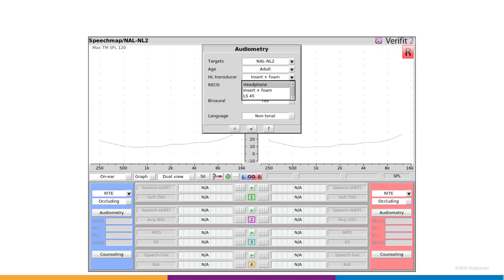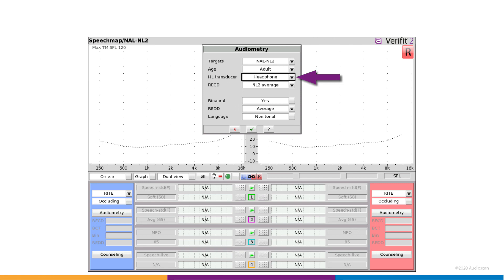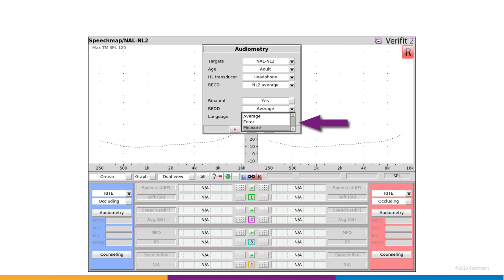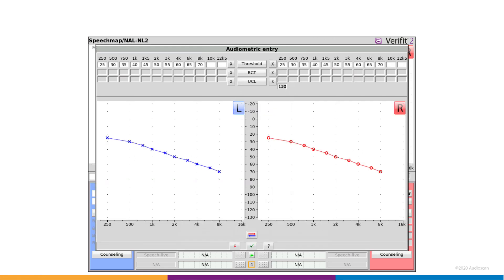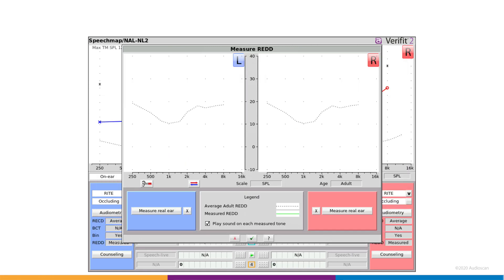In SpeechMap's audiometry entry, ensure HL transducer is set to headphones. The REDD selector allows you to select average data, enter previously measured data, or measure new values. Set the REDD selector to Measure and click Continue. After the audiogram entry screen, you're presented with an REDD measurement screen.